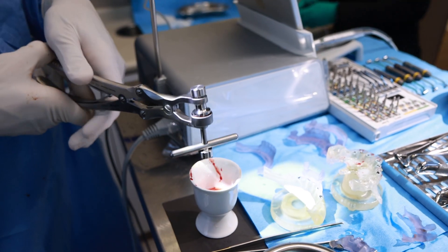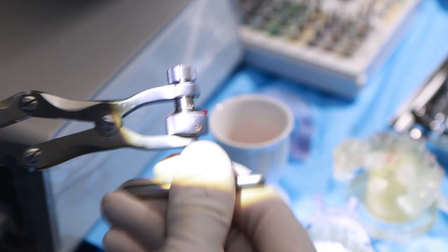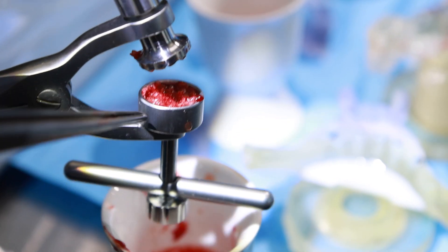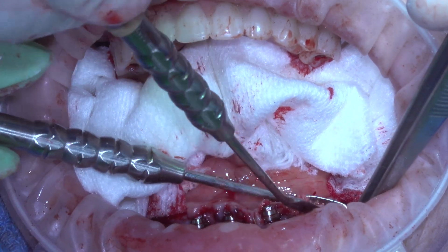Next, simply clamp down on the handles with one hand and hold the mill securely shut. With your other hand, turn the handle using this pattern: one turn back and forth, repeated a few times. Remove the autogenous graft material from the bone mill and pack it into the target deficiencies.